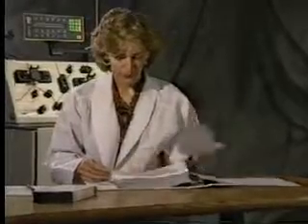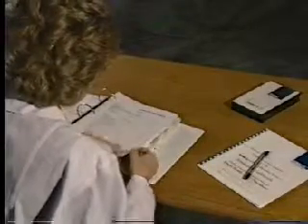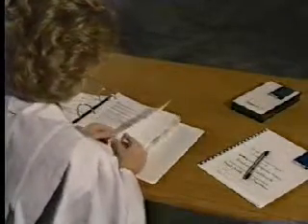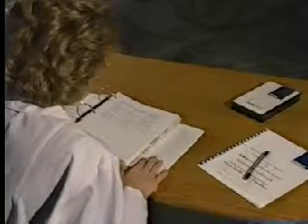Each operator should be thoroughly familiar with indications, contraindications, and warnings which can be found just behind the table of contents and before the introduction section of the Cobe Spectra Operator's Manual. Throughout this video, peripheral blood stem cells are referred to as PBSC.